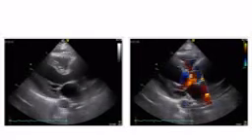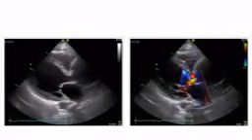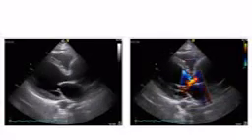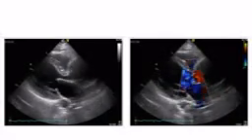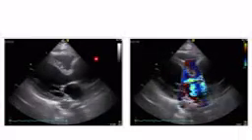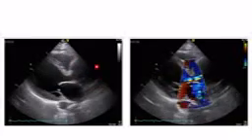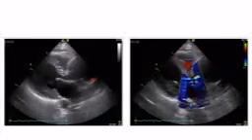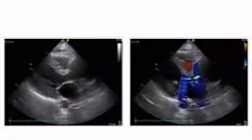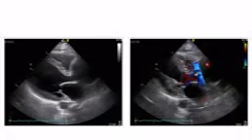Well, yes, at this point we can actually recognize the jet, which goes back into the left ventricle, and maybe from the 2-dimensional image we can also understand the mechanism behind it, because yes, we have this really enlarged ascending aorta, and maybe this is AR associated with dilated root. Yeah, the jet is very central. We have a massively dilated aorta.